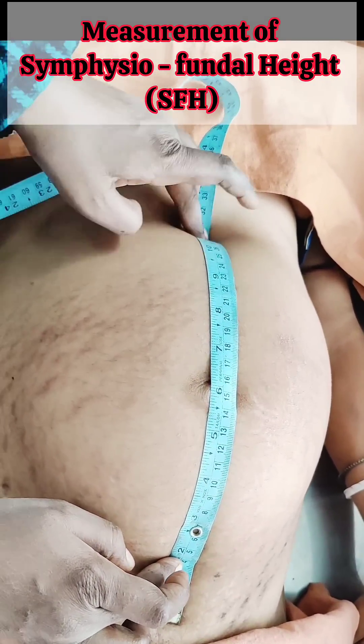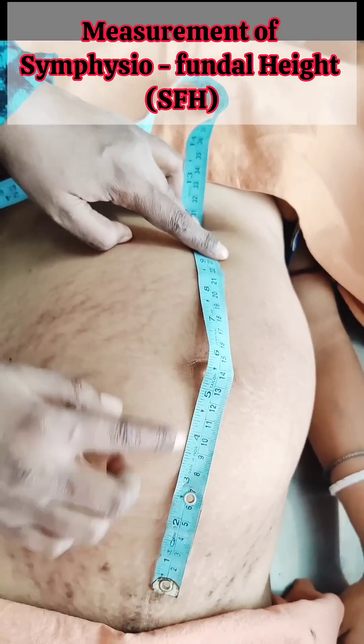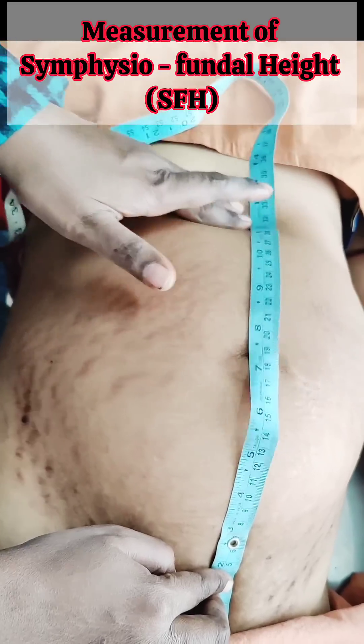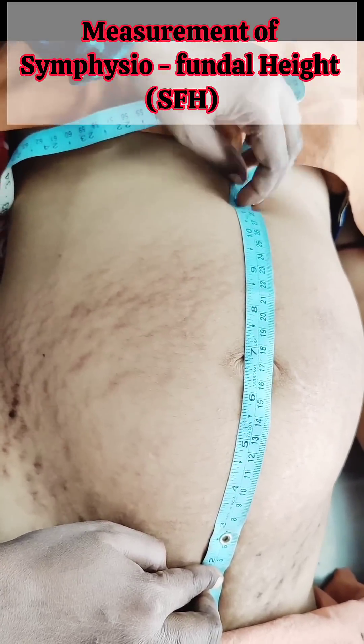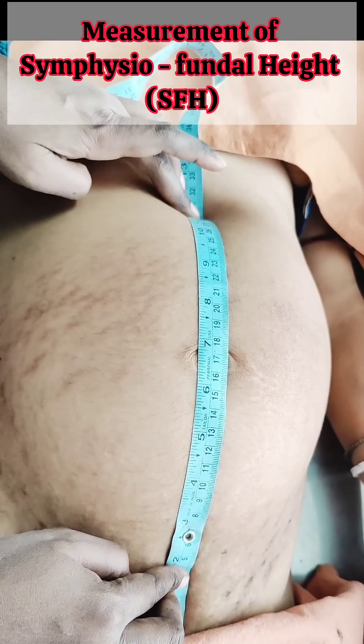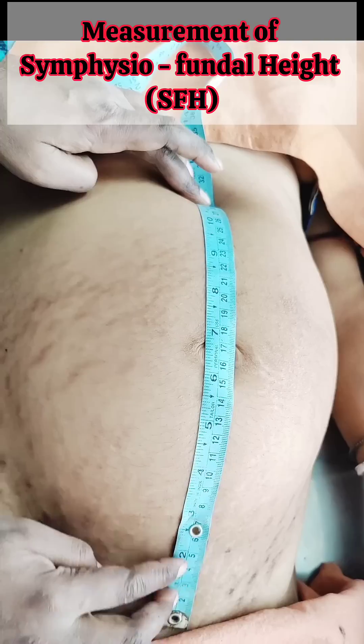Ideally, the measurement should be plotted on a customized symphysiofundal height chart. This chart should be generated at the first antenatal visit and customized for each individual, considering ethnicity, height, weight, and parity.